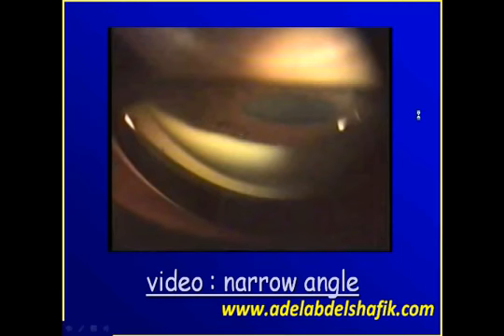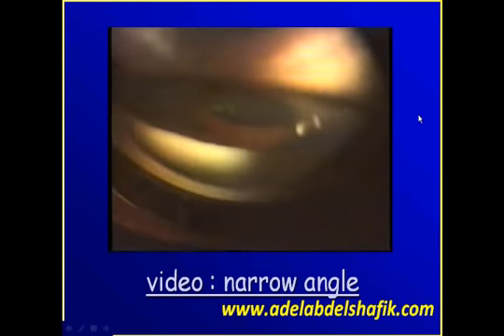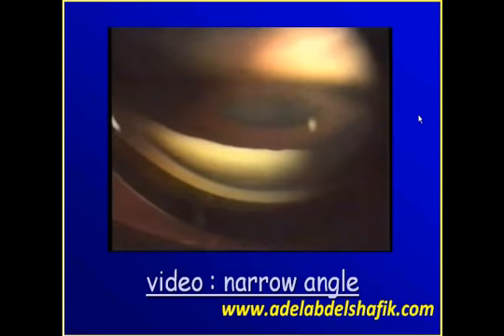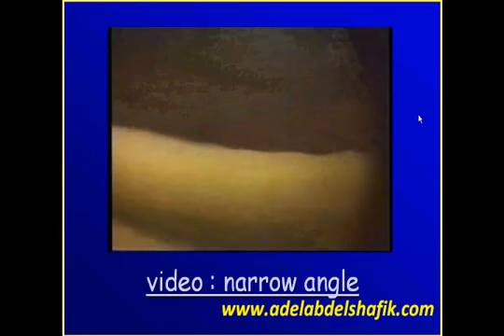While in this video, none of these are seen, so it's a closed or occludable angle. You cannot be sure it's really closed or not unless you do indentation gonioscopy.